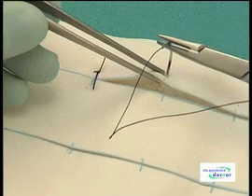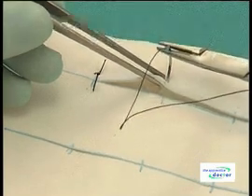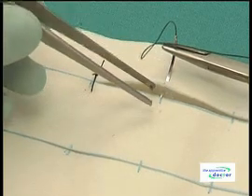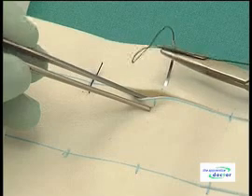Let the needle penetrate the surface of the imitation skin on the far side at an angle of 90 degrees to the surface. Let the needle penetrate both the epithelium and the dermis. Do not unclip the needle holder. Lift up the imitation skin on the near side of the incision with the tissue forceps.